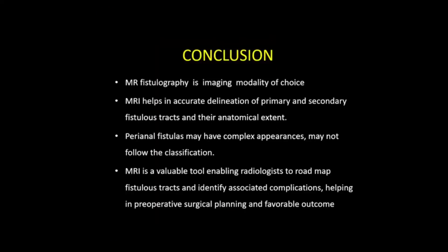Concluding, MR fistulography is the imaging modality of choice. We've come a long way from conventional to MR. MR helps in accurate delineation of primary and secondary fistulous tracts and their anatomical extent. Perianal fistulas may have complex appearances, may not follow the classification. MRI is a valuable tool enabling radiologists to roadmap fistulous tracts and identify associated complications, helping in preoperative surgical planning and favorable outcome. Thank you.